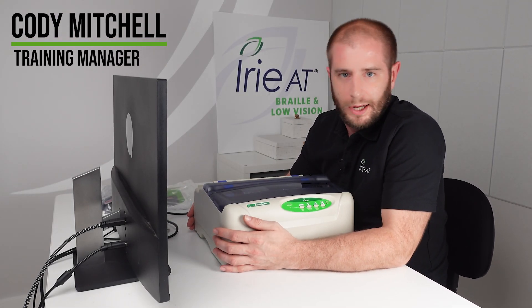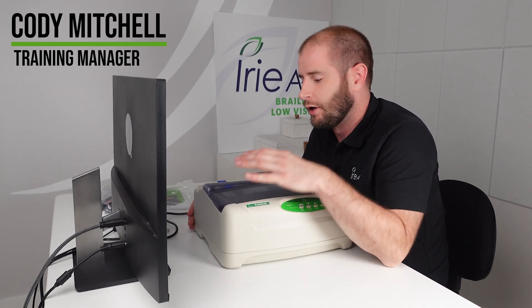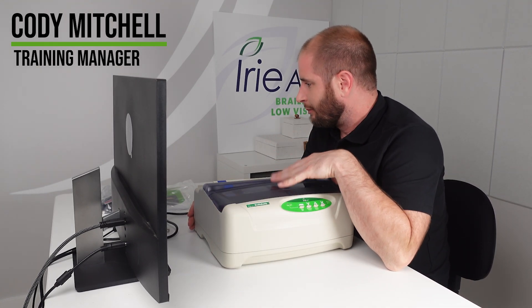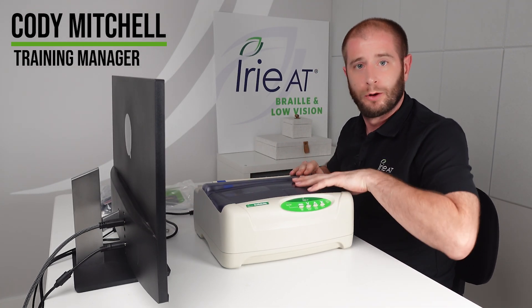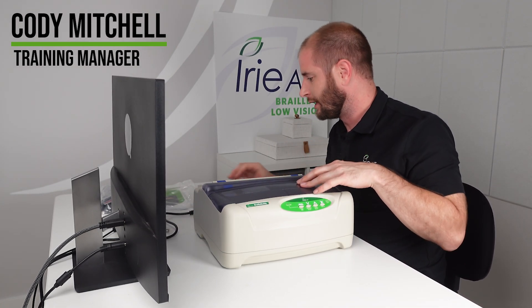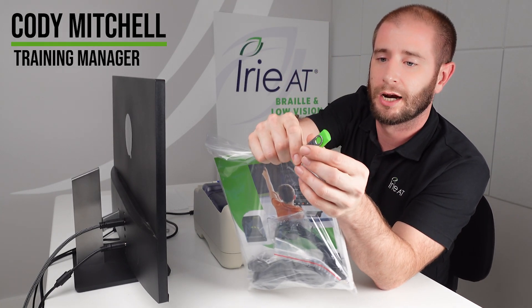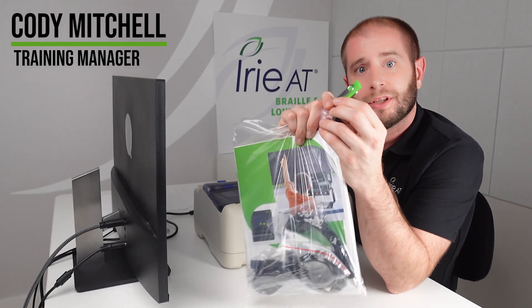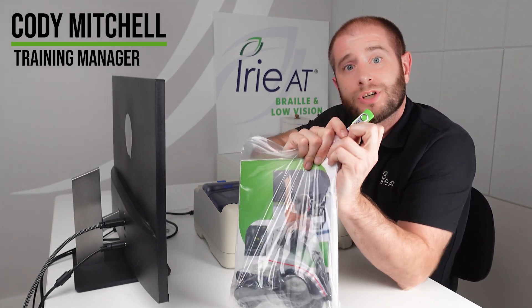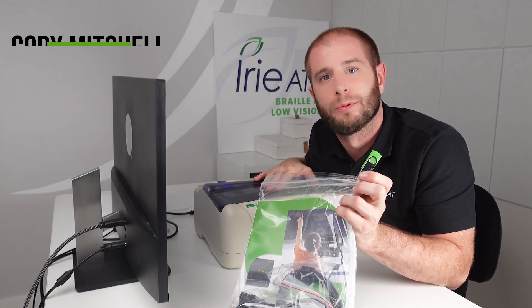We've been receiving a lot of requests to put together a demonstration or setup video of the BrailleBuddy Embosser, so we thought it would be a good idea to do just that. Before we get started on covering what all comes included with the BrailleBuddy, the most important thing to focus on first is going to be the Irie AT USB stick, which includes not only your software but the Braille printer driver, which needs to be installed first before connecting your embosser to your PC.